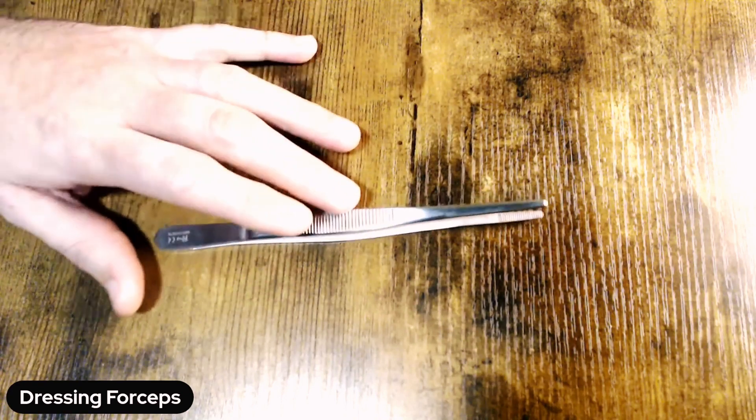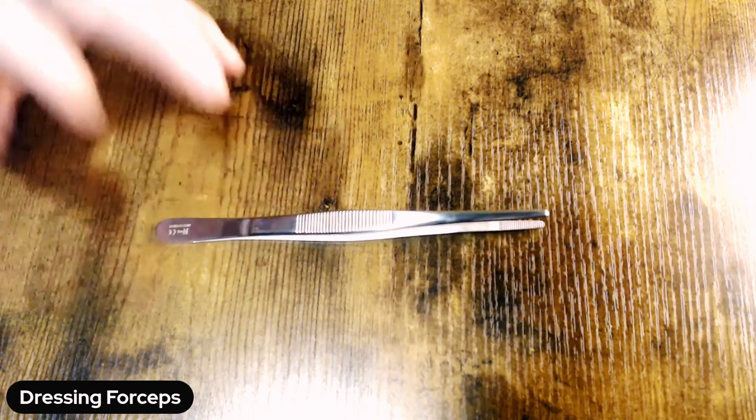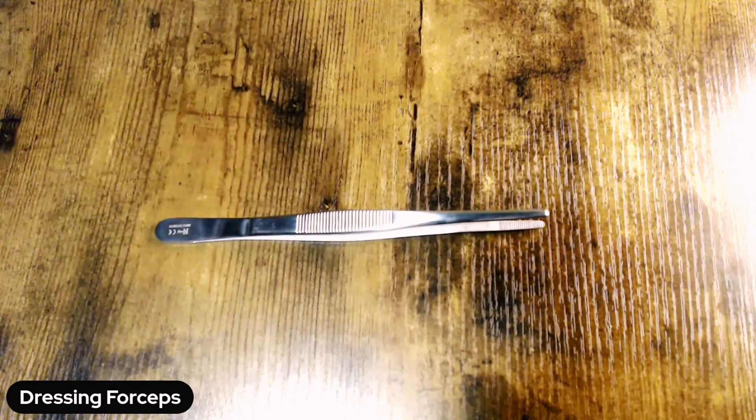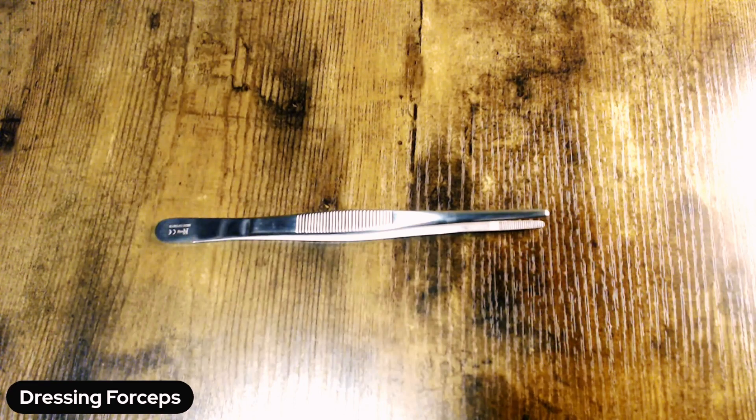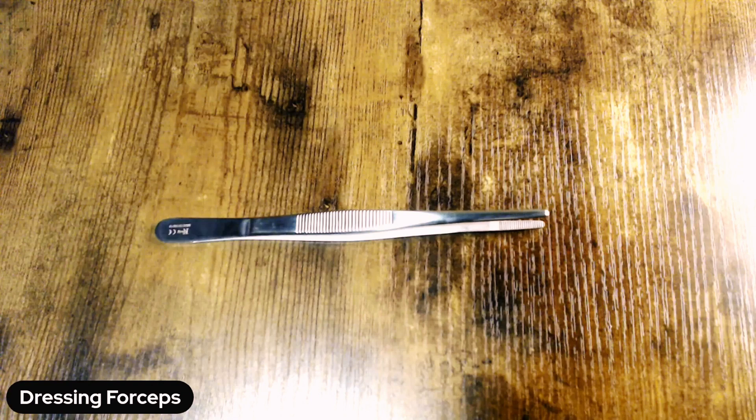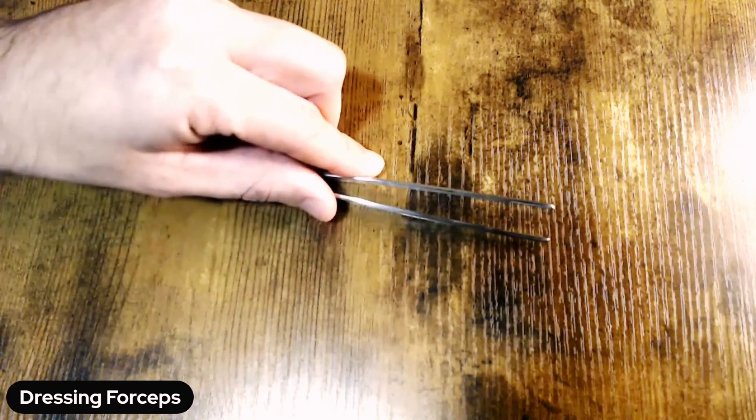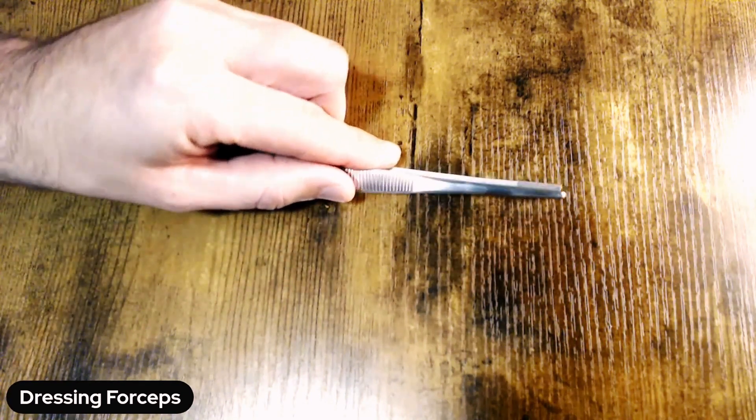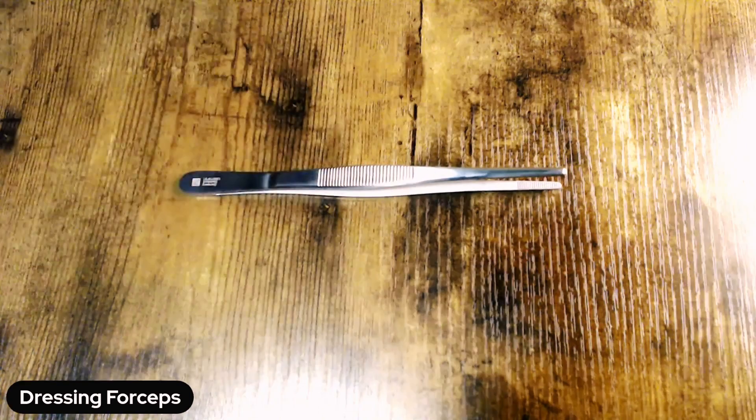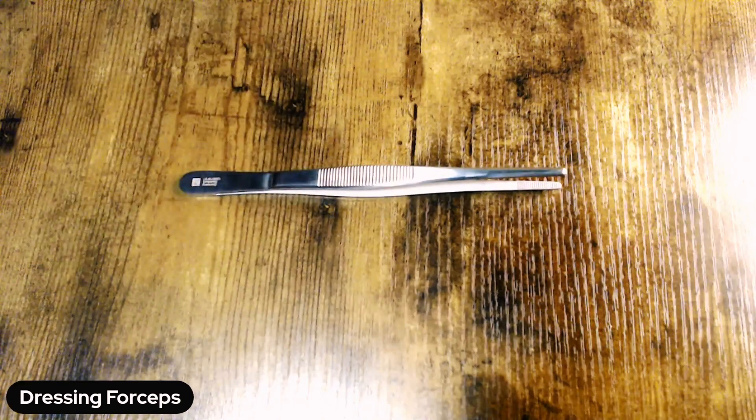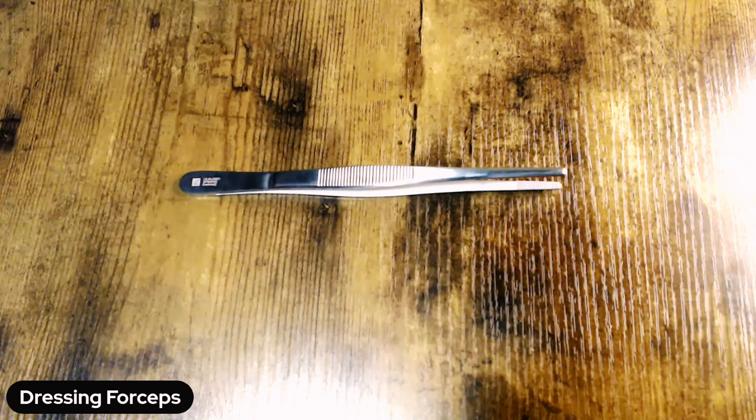But in fact, the dressing forcep, or as you'll see it sometimes called, the forcep without teeth, which is also confusing, does have serrations on the tip. And so that's an easy identifiable mark that you are handling a smooth or dressing forcep in the assembly area.